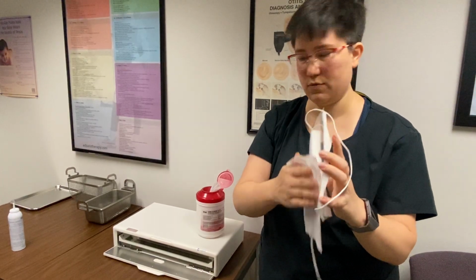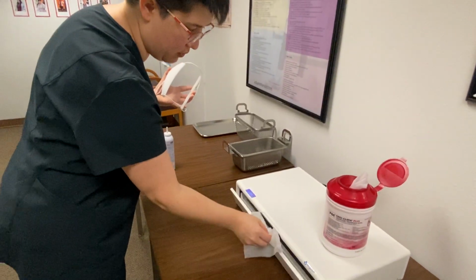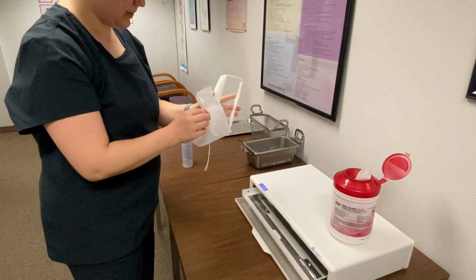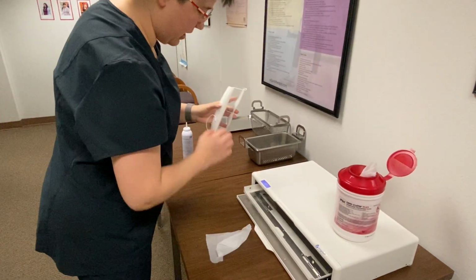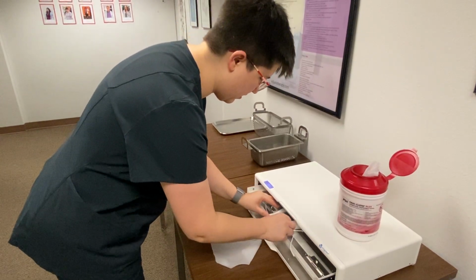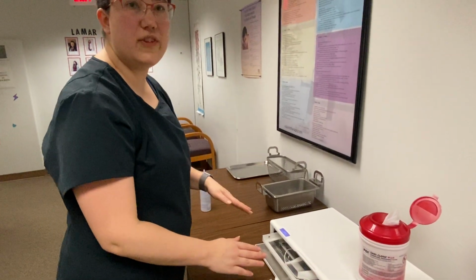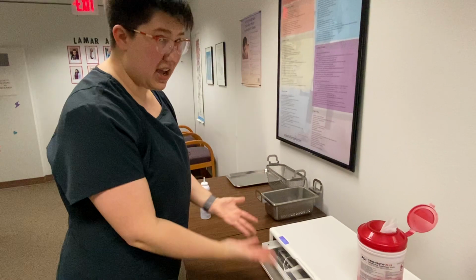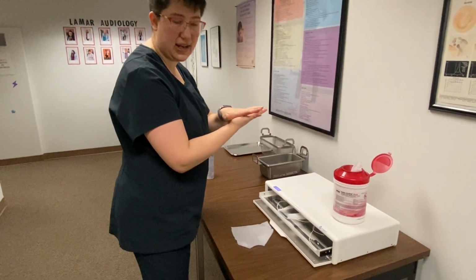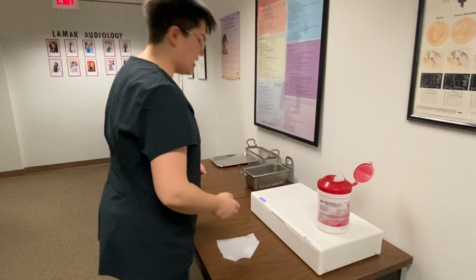So we wipe it down, and then we grab, if this is closed, we open it up, but you grab this and slide it out, and it just comes out a little bit. And then you want to put it all the way in here and the straps lined out. This is going to UV sterilize it from 360 degrees. This is a special kind of material for the tray so the UV light can penetrate it. We close it and shut it, and it starts a cleaning cycle.